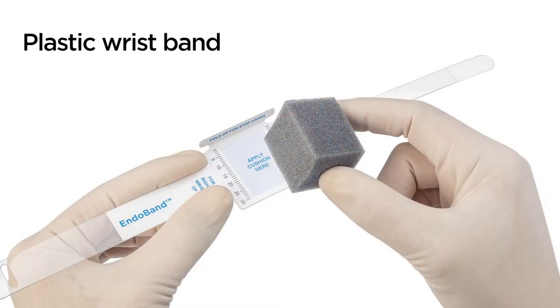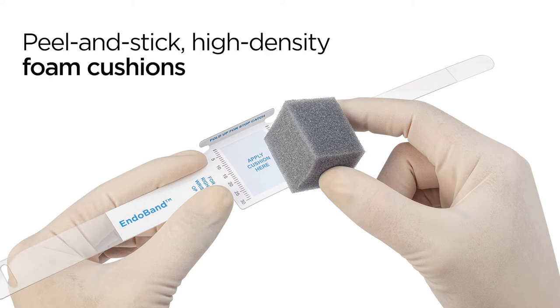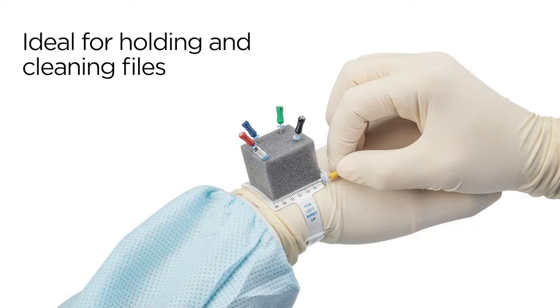The two-part lightweight EndoBand system includes a clear plastic wristband with a built-in millimeter scale and fold-up catch for accurate stop adjustment. Peel and stick high-density foam cushions are ideal for holding and cleaning files on the fly.